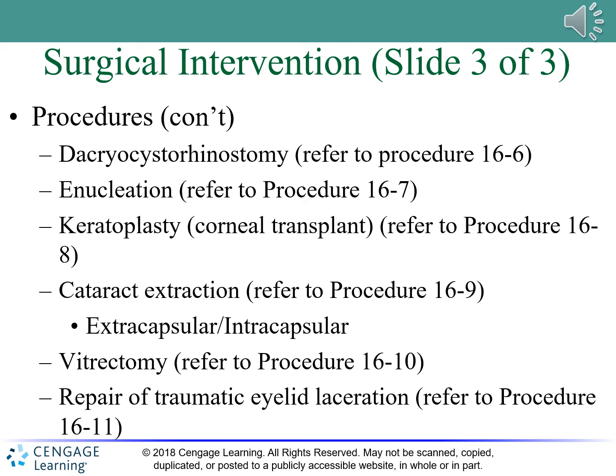Under practical considerations, so that's second column in the first bullet, there's intraocular. Okay, so these are the different gases. So intraocular, or inside the eyeball, intraocular gases. Halfway down, gas is useful for flattening a detached retina and keeping it attached while healing occurs. Gas injection is also used to close macular holes. It is frequently necessary for the patient to maintain a certain head position following surgery when gas is used.